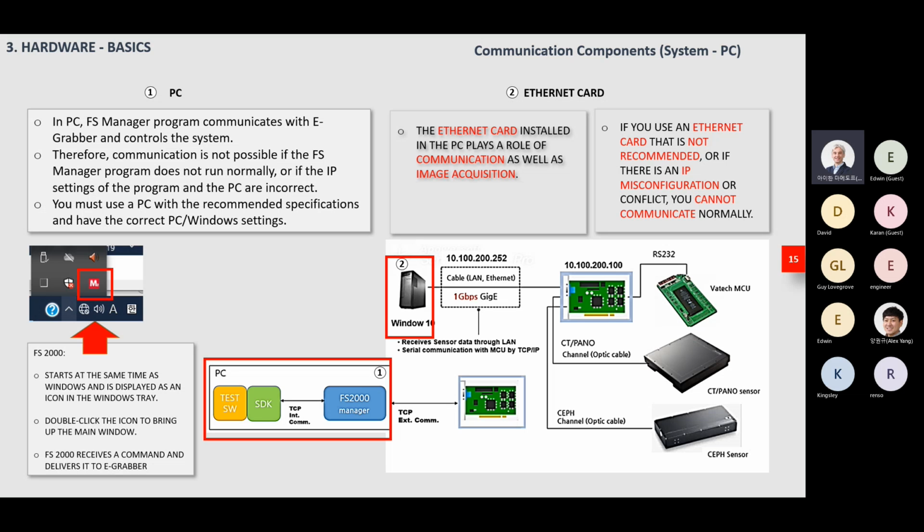All right. So first, what I want to say is that before starting to fix anything, the best thing is to make some kind of checklist for yourself. You just check if the connection is good, if the cable quality is all right, if this icon is on. If everything is fine but there is still an image acquisition problem, then you can further check the devices that these cables are connected to.